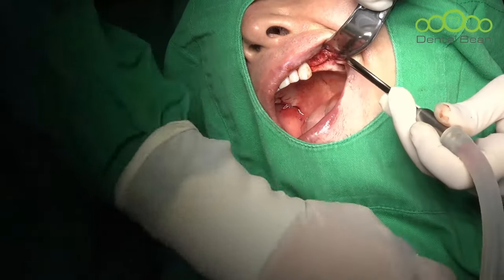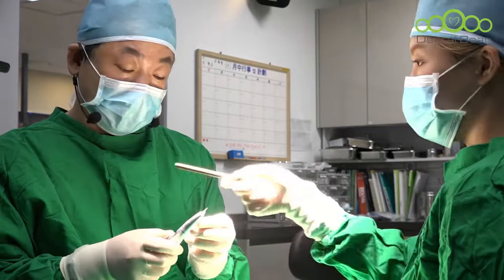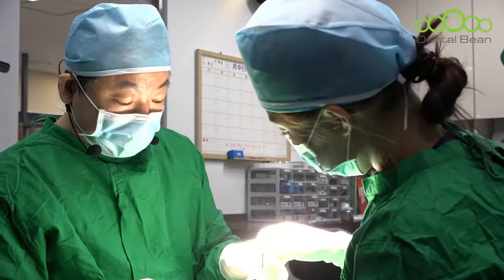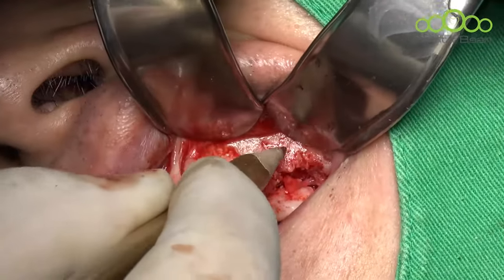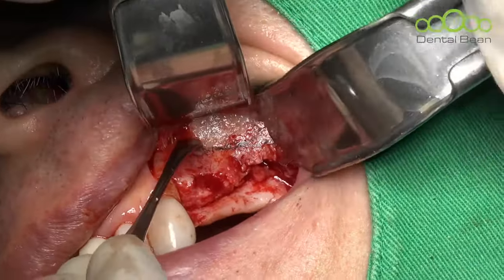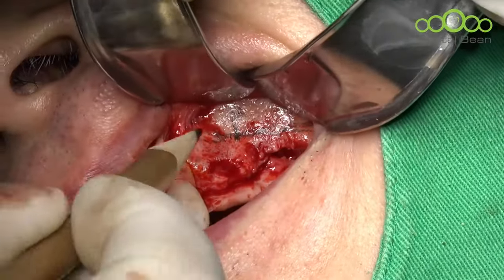Let's open the lateral window. First, I will design the bone window. Patient has a septum and I will draw the sinus. I'm watching the panoramic radiography, and here is the sinus, okay, and posterior here. Then my window must be moved upward, like this, okay. And the septum exists in here. So, not so easy. I will make the window here.